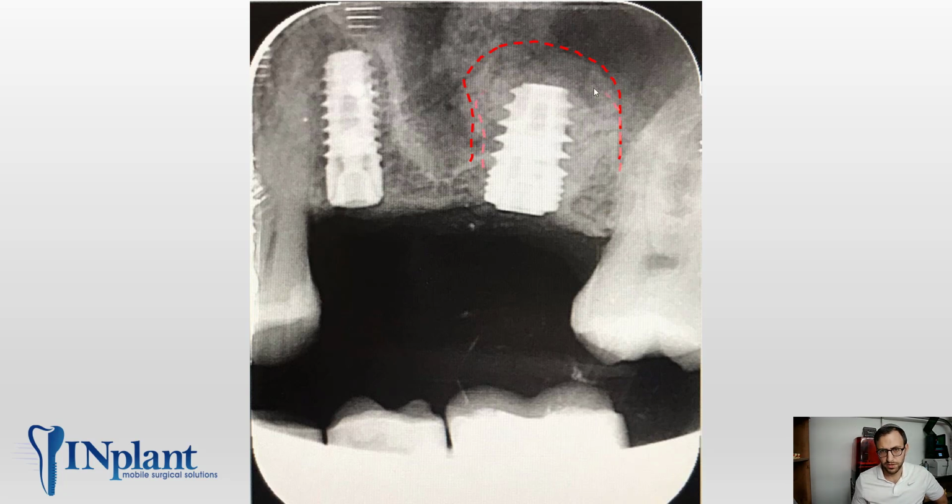In my experience, what we're going to get is about a lift till there. I think that'll be where everything will settle in. All this will clear out on the top, and we'll get it settled in area. If we didn't put the implant in, what will happen is that it'll tend to sink down, and as it sinks down, you'll get less actual lift.